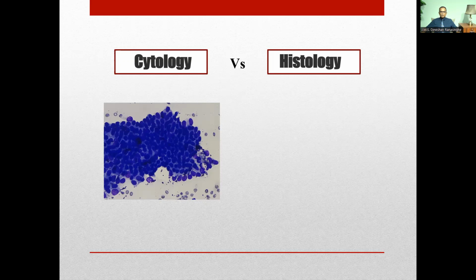Based on these things, we are going to comment on the cytology report. In addition to that, we are going to comment on the other cells which are distributed in the other areas of the smear, as well as the background things. As an example, there may be necrotic material or some inflammatory cells which are distributed around these cell clusters. So these are the usual things we comment on in cytology.